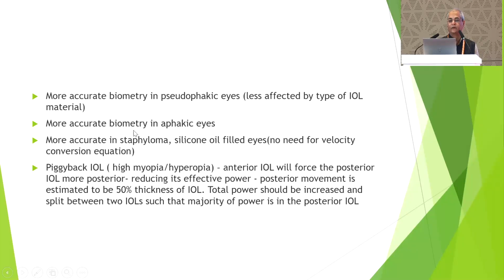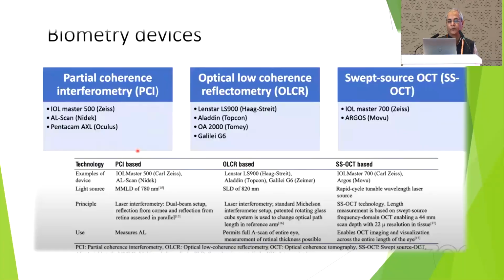So these are the few things in pseudophakic, aphakic, staphyloma, and silicone oil eyes. In these you have to make an adjustment in the ultrasound biometer, while optical will be taking without this. So definitely optical will be better in that.